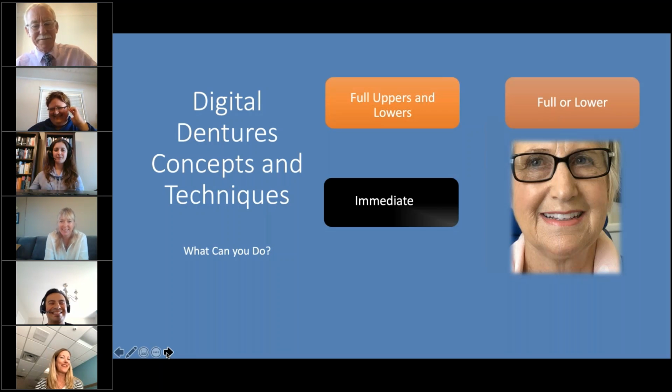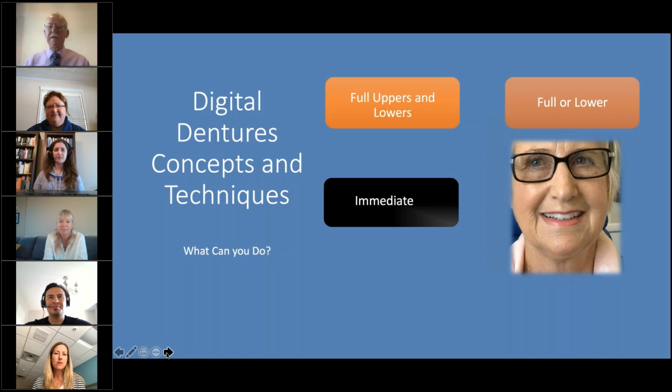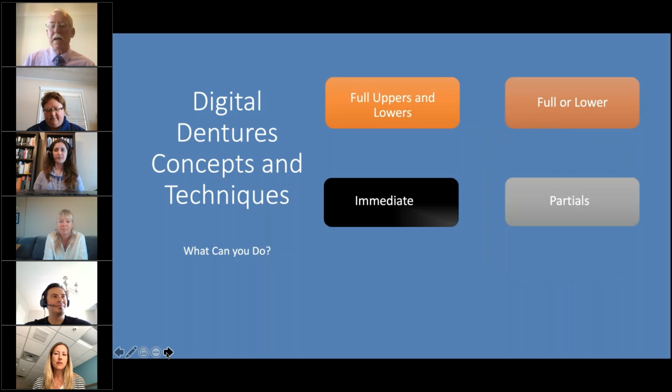No, I do have a few dentists that do a lot of immediate partials. They'll take a scan in the morning, and I've milled an immediate partial straight from the intraoral scan, and it's in there before 5 o'clock. That immediate there is done in a monoblock, whereas there are now multilayered pucks and partials.